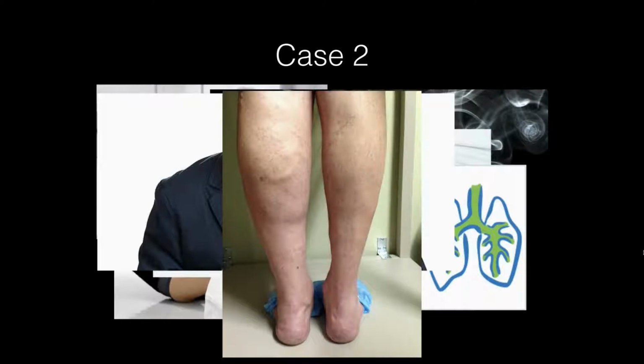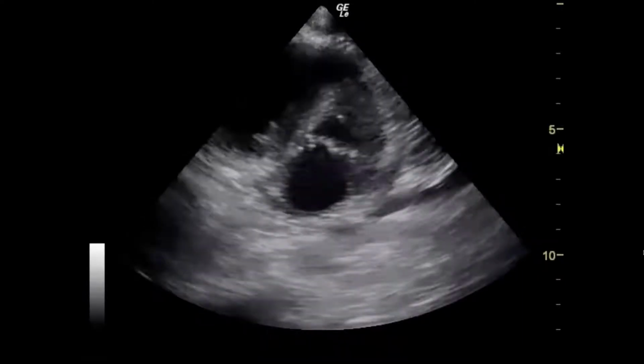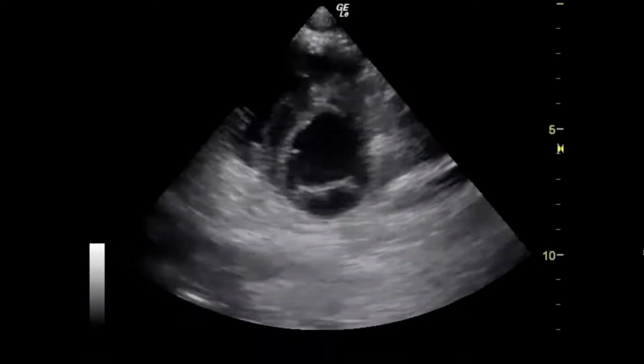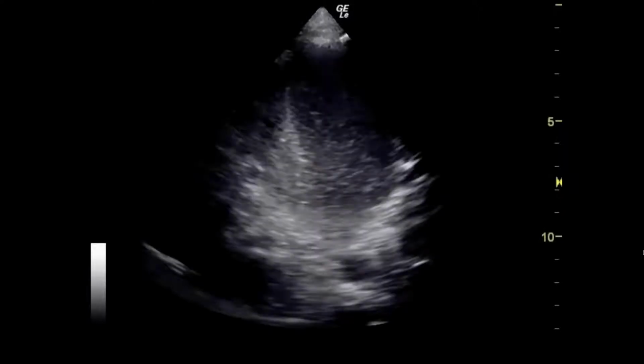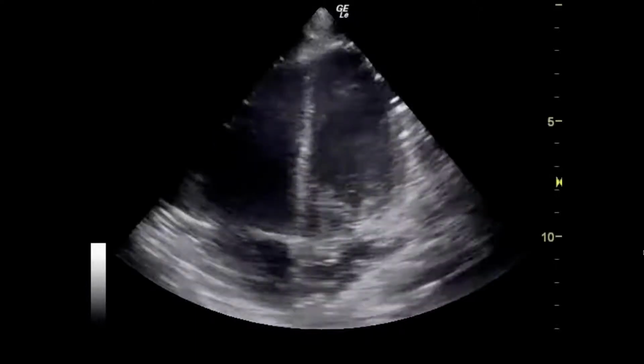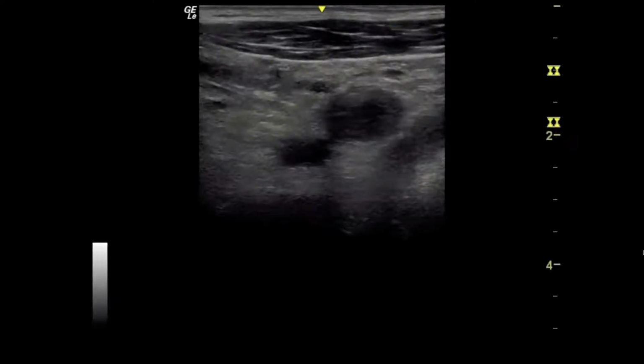So we were assessing this patient, asking if this was a COPD exacerbation, or heart failure, or also the thing that we were looking for, pulmonary embolism. With this echocardiographic approximation, we found an enlargement of the right ventricle, as you can see here, almost the same diameter as the left ventricle. We also assessed the left leg, and we found a clot that wasn't compressible at the common femoral vein. So we made the diagnosis of a deep vein thrombosis and a possible embolism with hemodynamic repercussions. We asked for a CT, and the CT actually showed the pulmonary embolism.